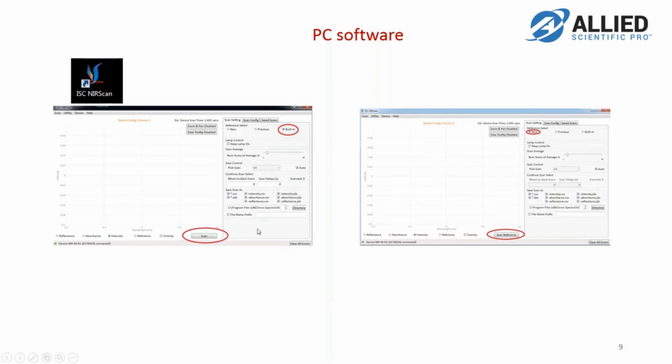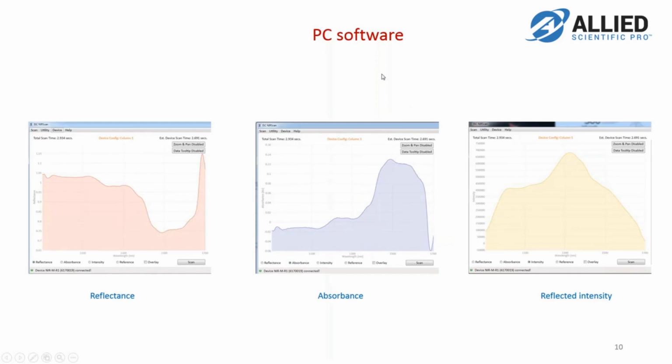Of course, the software also creates CSV files, and you can record the measurements and later refer to them.